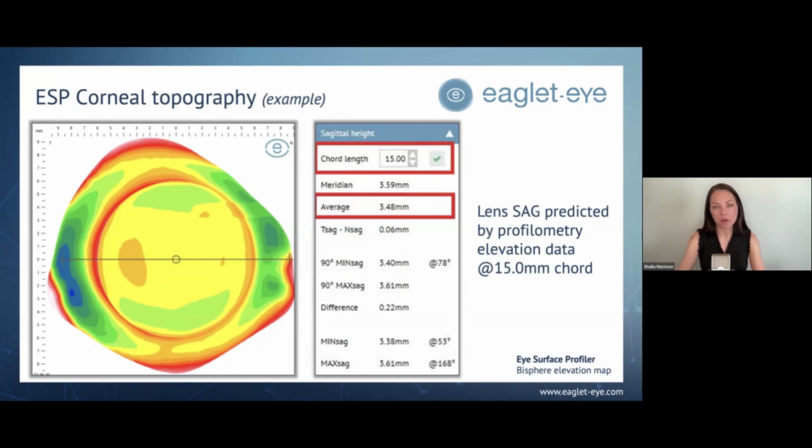And sometimes what I find in the clinic is if I'm running into a roadblock where a patient is just not happy with a lens fit, uncomfortable, can't really figure out why, sometimes it can be linked back to an inappropriate height of a lens to an eye that just isn't that height. And so using SAG data does help normal shape eyes. And in this case, we used it to help design a custom soft lens for a patient.